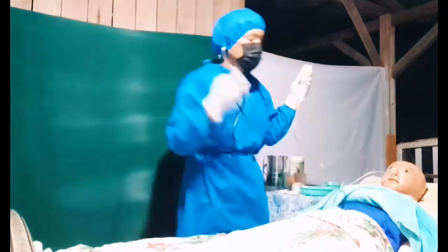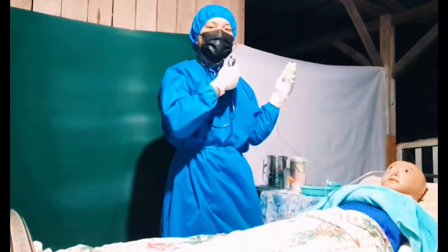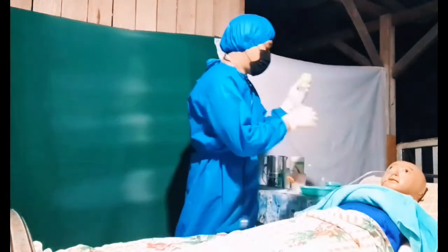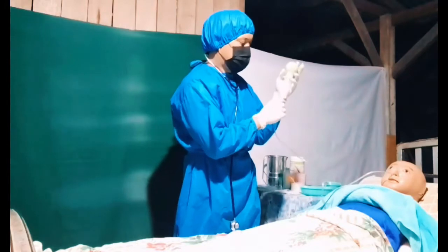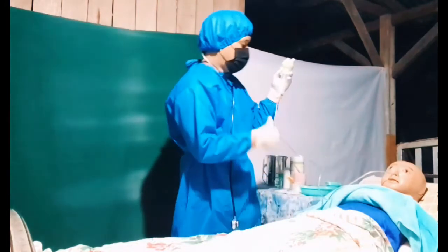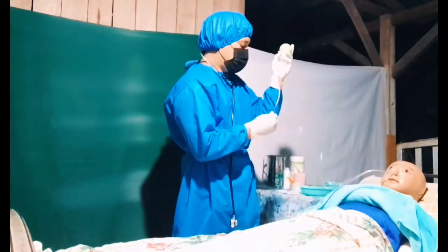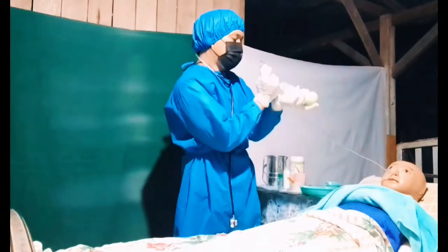Okay. Another procedure in checking the placement of the tube is the gastric content. The gastric content will rise up to there and then lock the NGT tube.